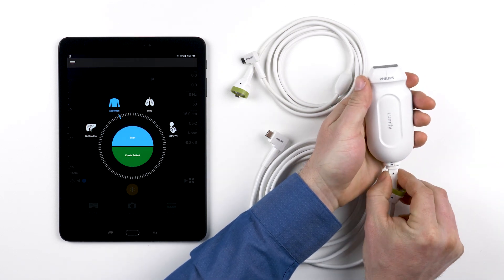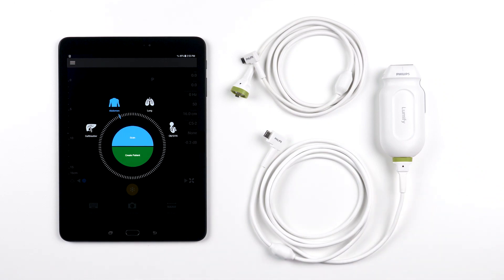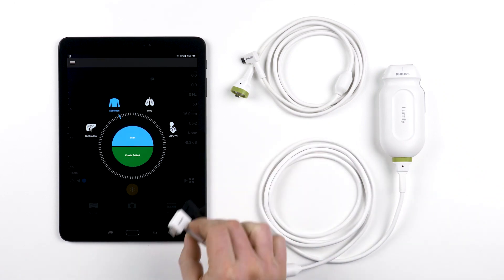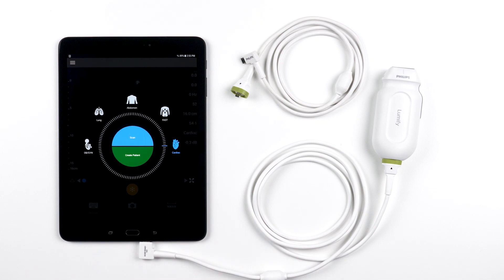This means your investment in Lumify is protected against changes in the tablet world. When you buy Lumify today, Philips will make sure it works with tomorrow's technology. Lumify transducers have been durability tested and are the toughest Philips has ever built, backed by a standard 5-year warranty so you can rest easy knowing your investment was built to last. Now you know a bit more about your Lumify transducers, and you can use your system confidently knowing it was built for you.